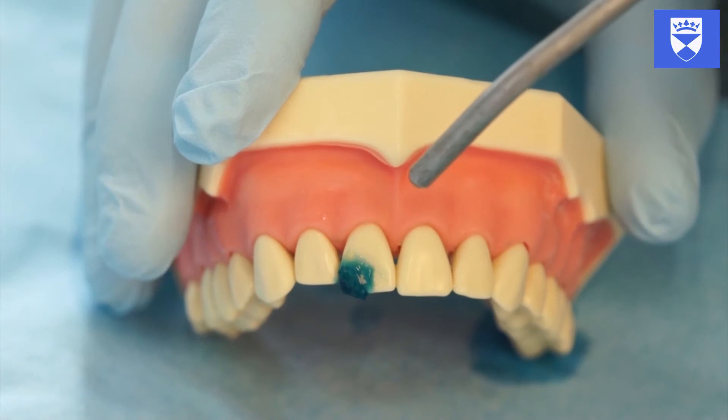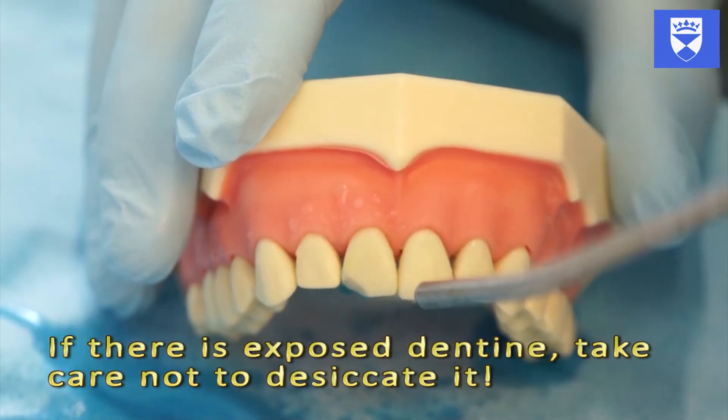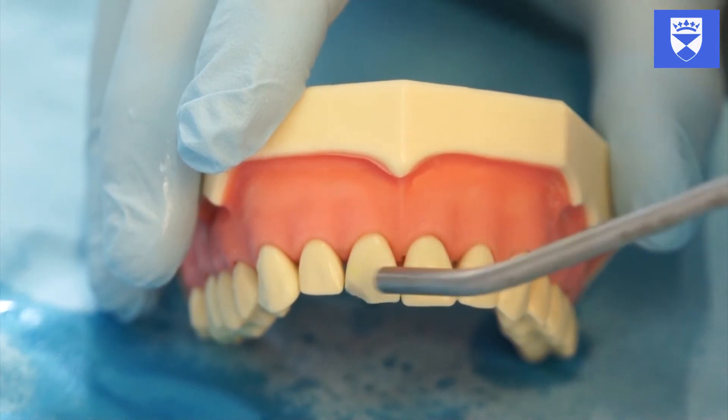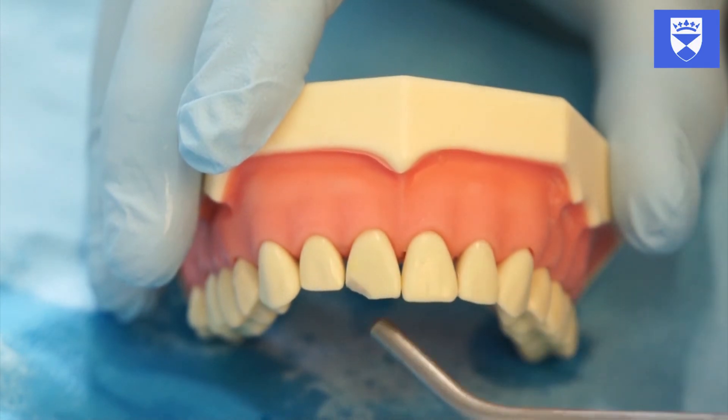Thoroughly rinse off the etch and dry the tooth. Observe enamel frosting. Apply bonding agent to the tooth.